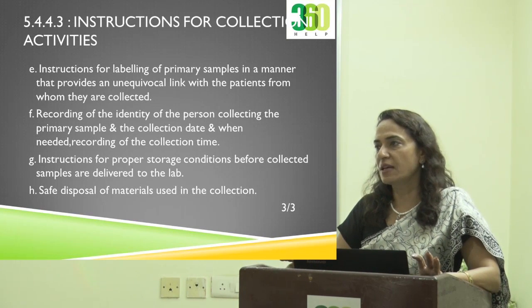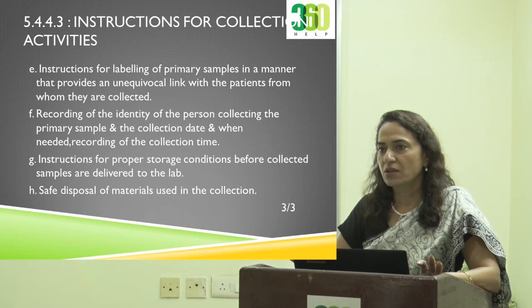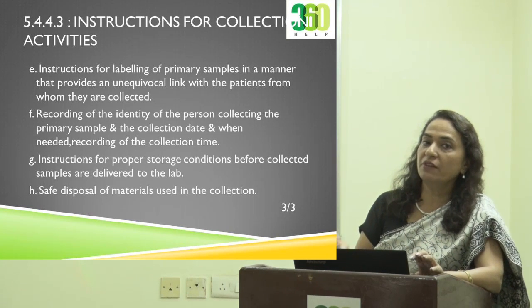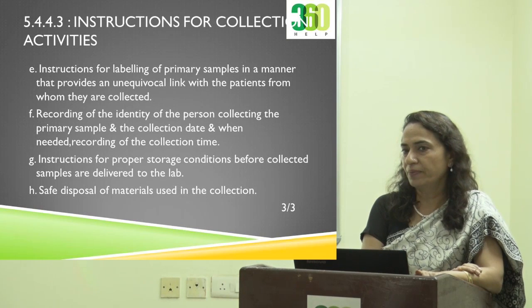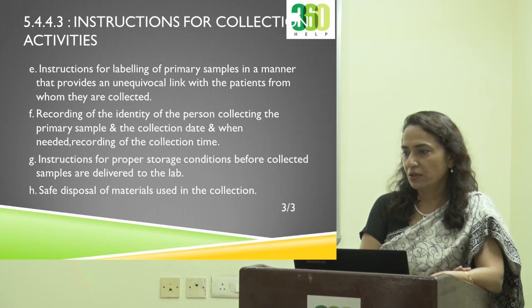Because there are certain samples, maybe you are not performing immediately, you are performing after 2 days, 3 days. So how they have to be kept, that should be known. Some samples have to be moved immediately from the collection area to the lab. How a semen sample has to be handled, how a prothrombin sample has to be handled, that should be known to the people.